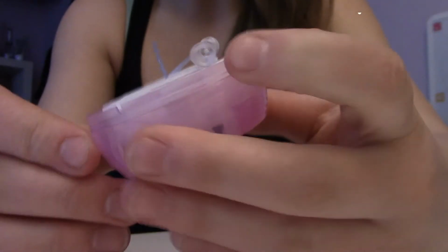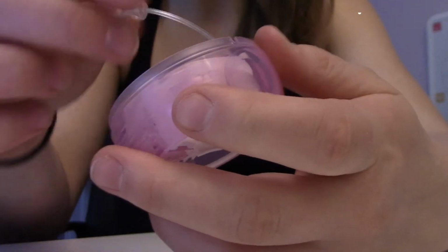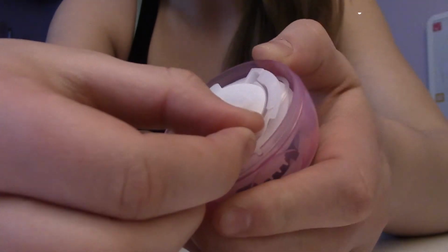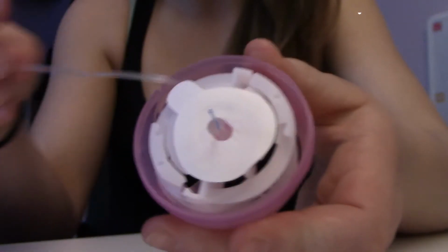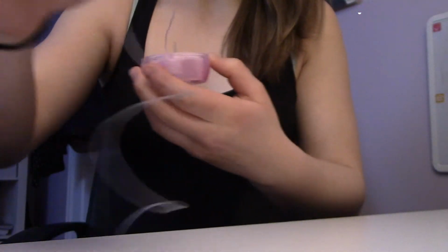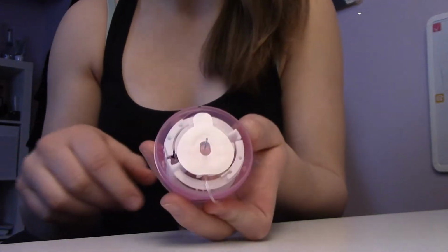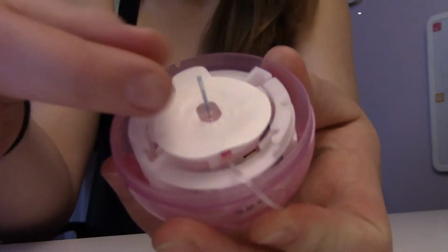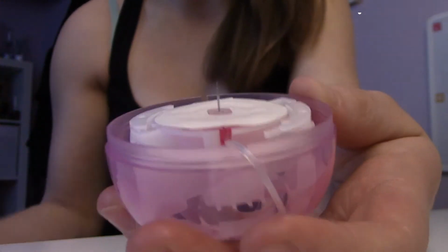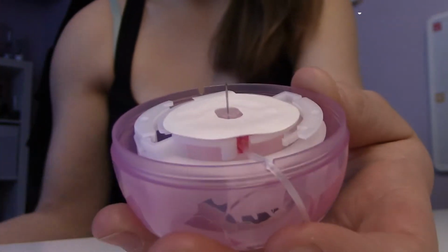So this next part, you just have to be a little bit careful that you don't pull the whole insertion site out. So you need to unhook the plastic part from the circle around it. So I just pull and then slowly take it out. You know it's done when obviously nothing else comes out. Next thing I do is I take off this blue little needle part. As you can see, that's the needle that's going to be pushing your insertion site into you.